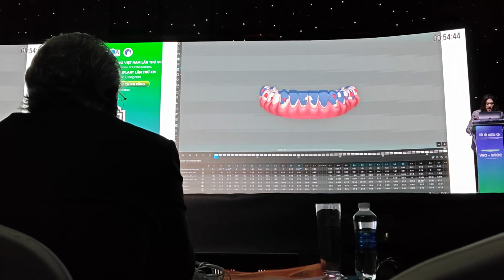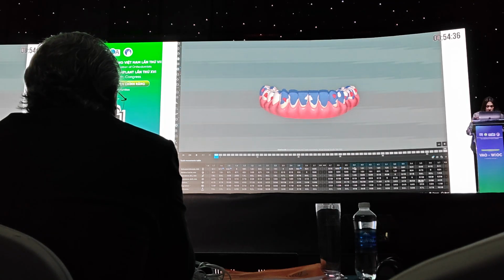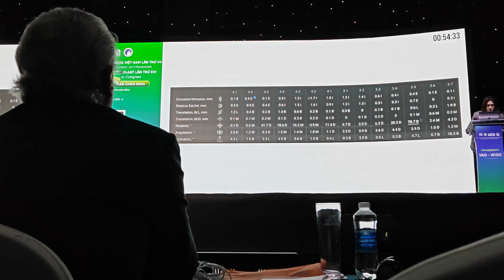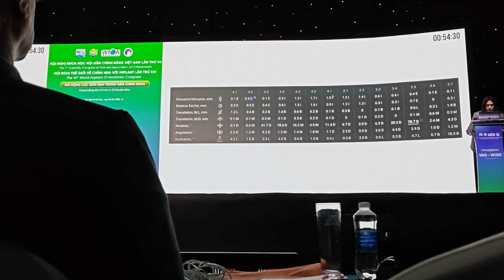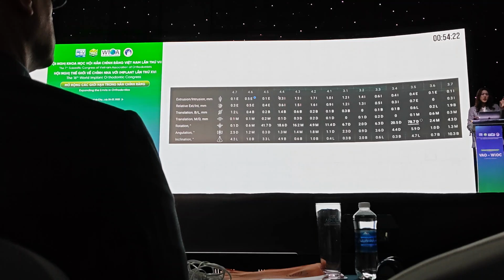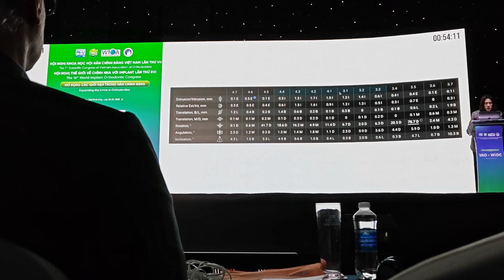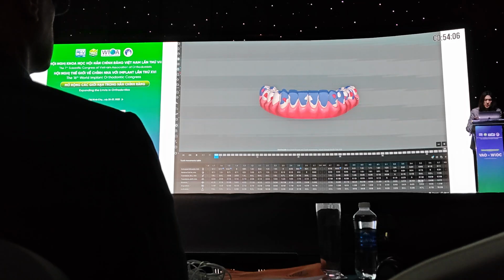And we can see that this kind of aligner activation is applied when we look at the tooth movement table here, the lower incisors. And if you magnify, you see this blue shaded area. This means that there has been aligner activation planned on these teeth, and they don't really tell you which kind of aligner activation, but we can see from the tooth movement table that because we have intruded here, right, that aligner activation is designed. So it was this patient.